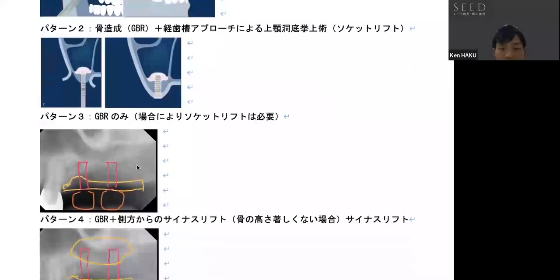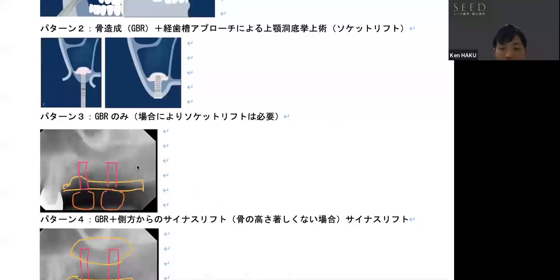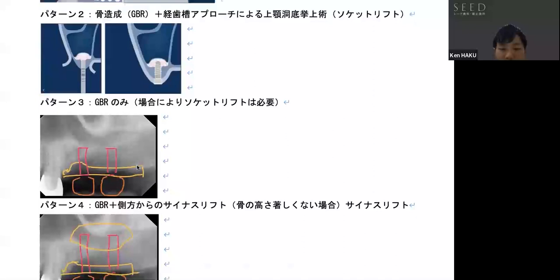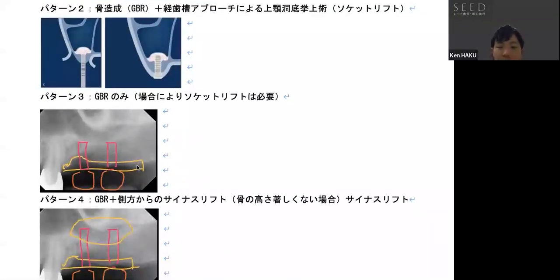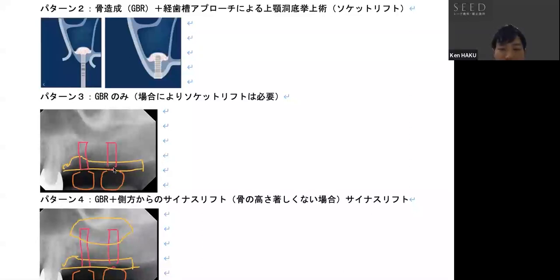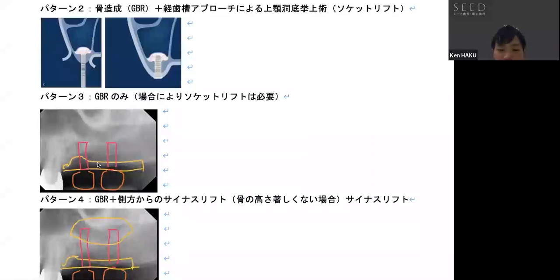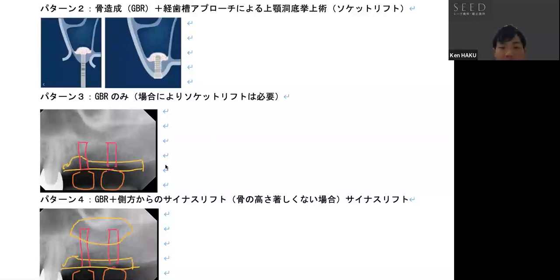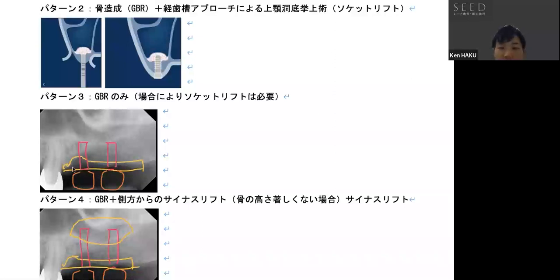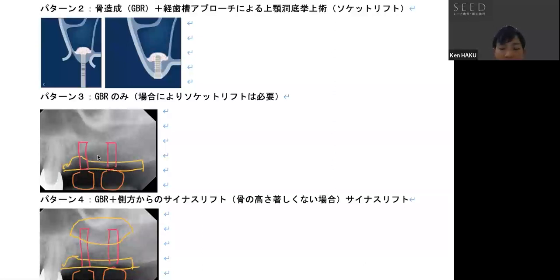Pattern number three is GBR only. As I mentioned earlier, only bone is added to the upper part. In this x-ray picture, the black area here, the black area is where there is no bone. Now, there is a tooth here, but the bone level needs to be equivalent to the height of the surrounding bone for the implant.